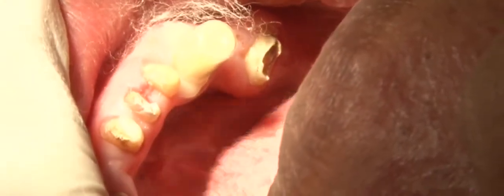After sufficiently curing the buildup, the preformed cap is removed from the tooth and excess is removed from the margins of the tooth.